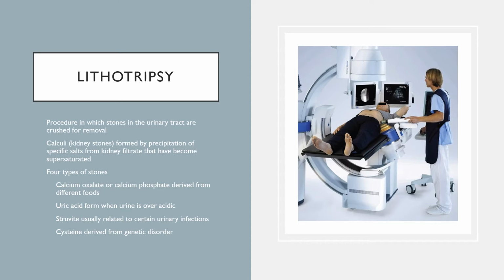that stone. Okay, we can also do them, as I said, intracorporeally. This is where a ureteroscope is used. Ultrasound energy can be delivered by a probe as well. Stones are crushed and particles removed with graspers and irrigation.